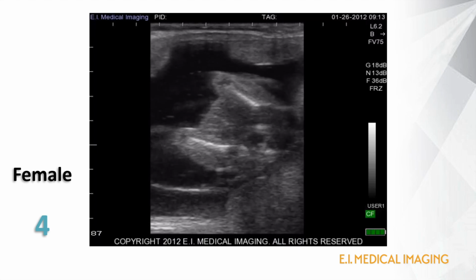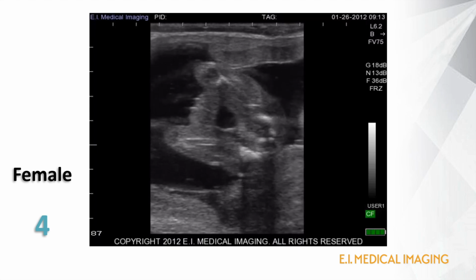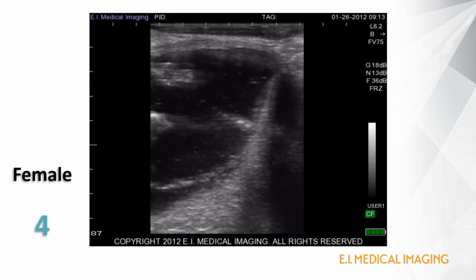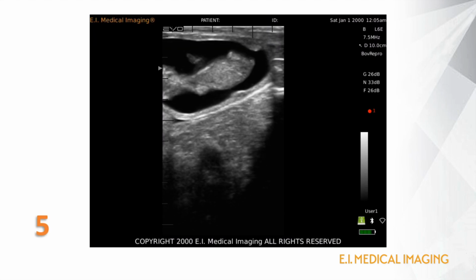Fanning toward the head, the umbilicus comes into view, with no male GT seen. As we come back toward the hind end, the vertebrae within the tail obscure the area of interest to some degree, but a female GT, which at this stage is much more fleshy and less dense, is visible. This is a heifer calf. Number 5.